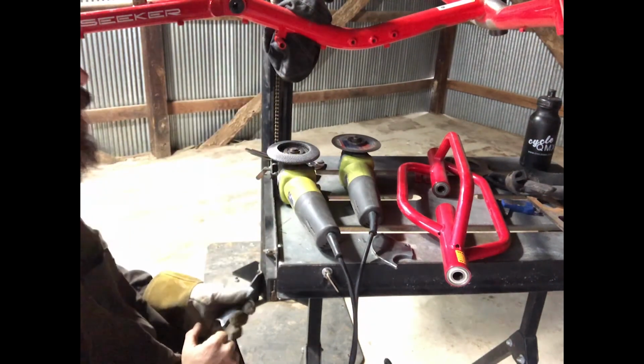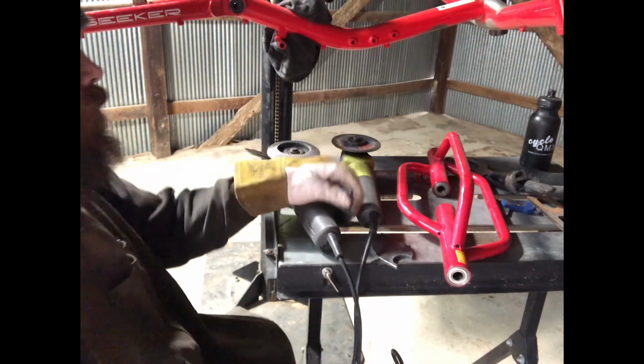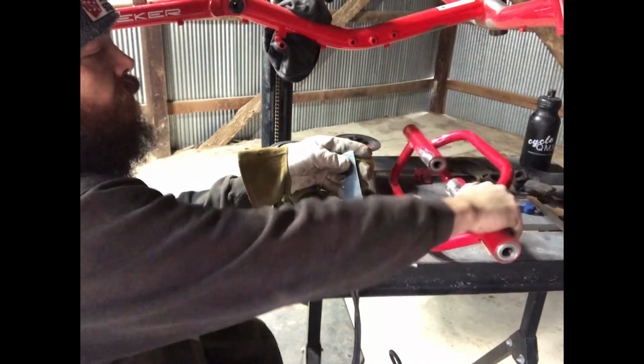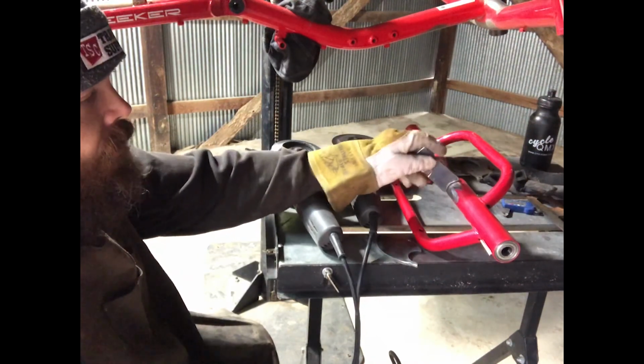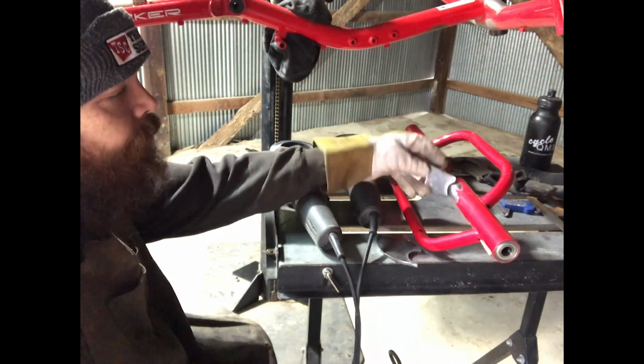This is our part, ready to go. Do a little cleanup on it. Next, now that we've got our parts all cleaned up, I think we're about ready to weld. What do you think?